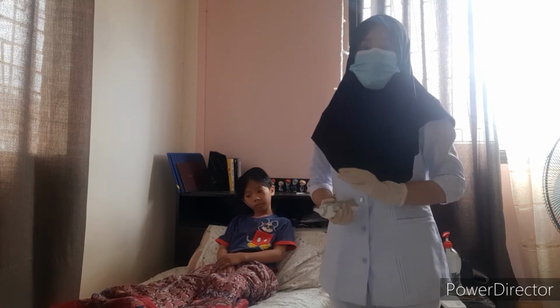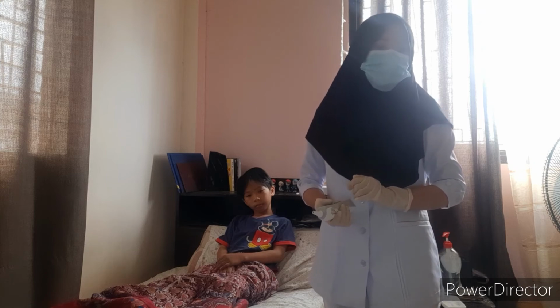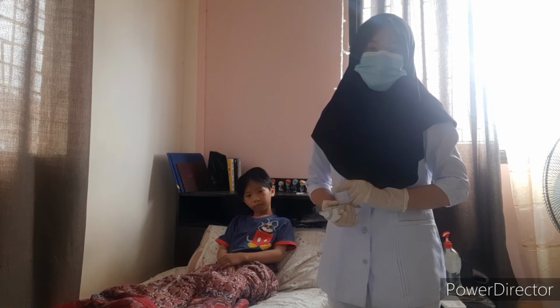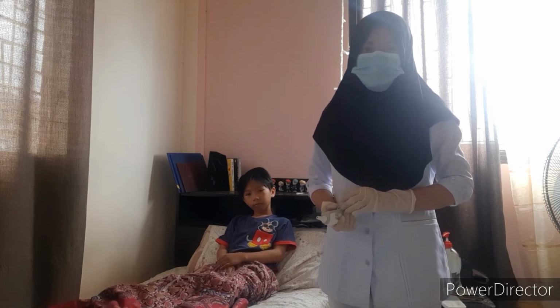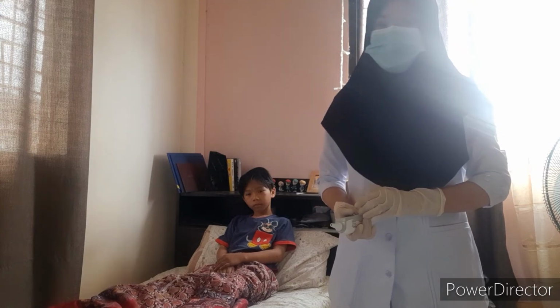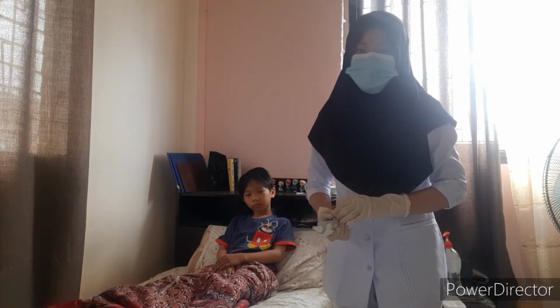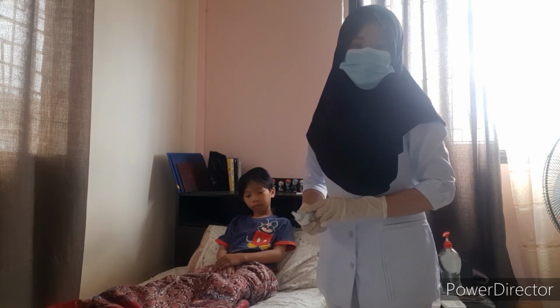So insert the tympanic thermometer into the ear canal for 1 second while an infrared sensor records the body heat radiated by the eardrum. So the tympanic thermometer relies on the radiation of body heat through the infrared sensor.